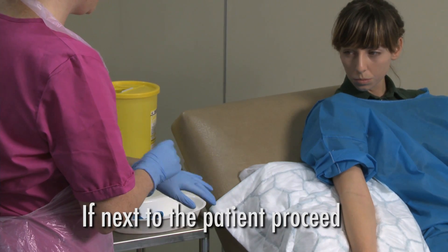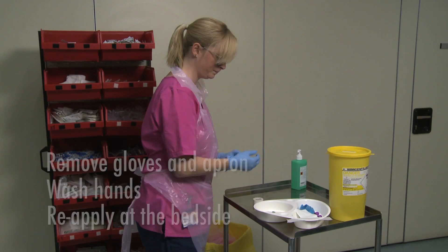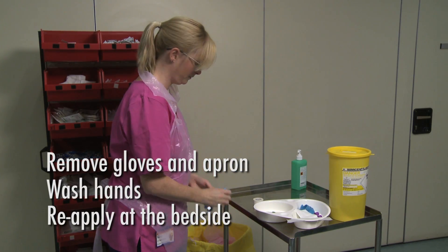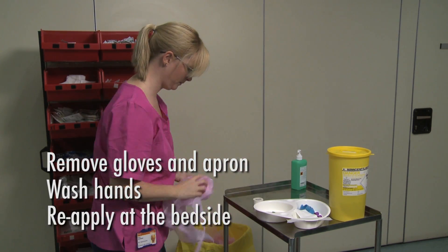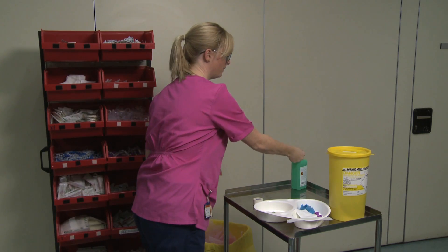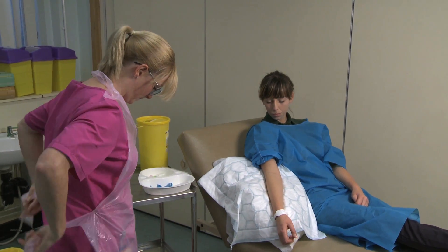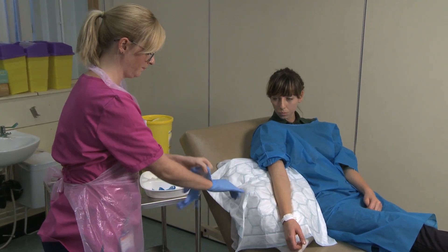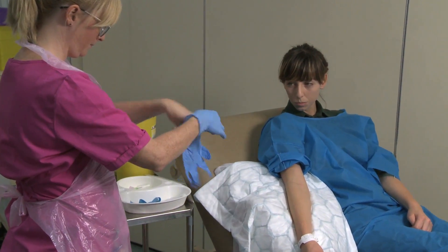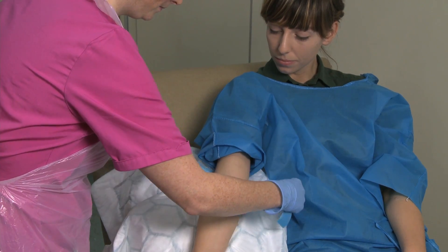If you are next to the patient, carry on and perform the procedure. If not, remove gloves and apron, wash your hands and reapply at the bedside. Position the arm to optimise venous dilation and filling. Speak to the patient and tell them what you are doing. Apply the tourniquet seven to eight centimetres above the chosen site.